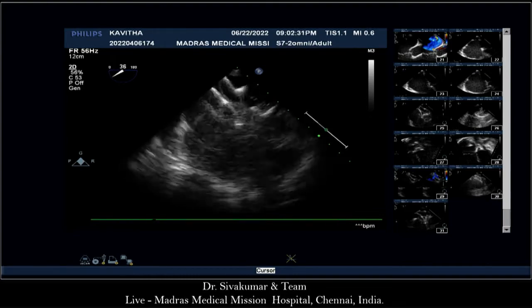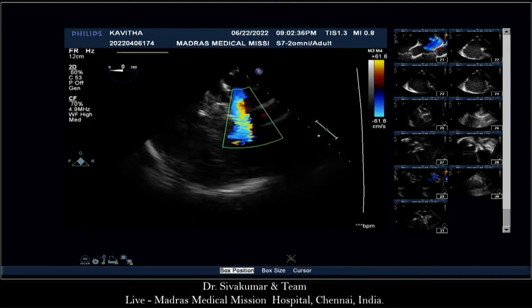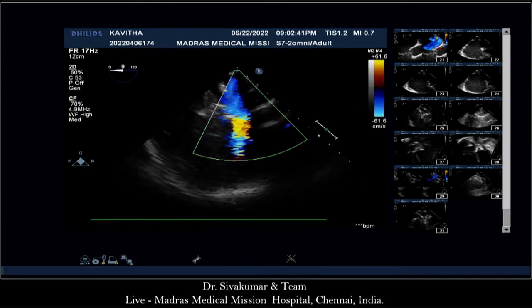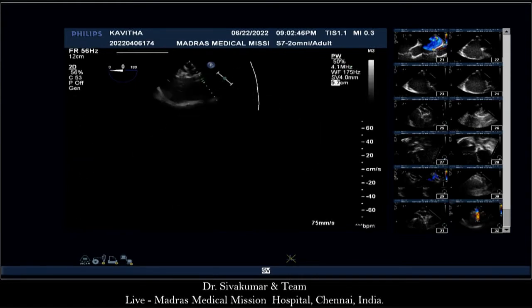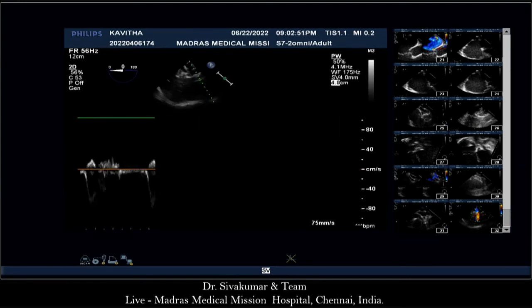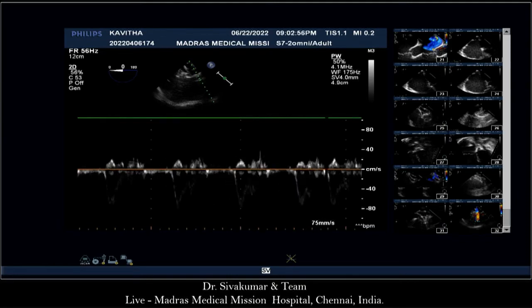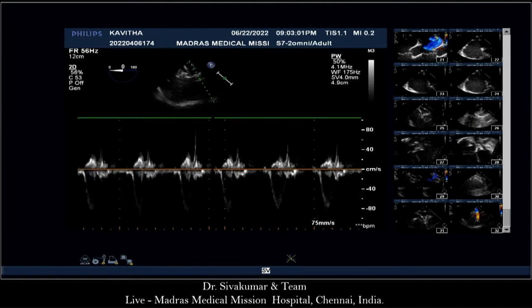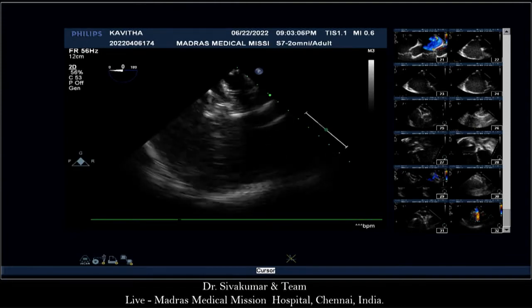And color. It'll be good, don't worry. It'll be okay. I'm trying to be like Dietmar now. The color machine is rubbish. Yeah, correct. Actually, there is some electrical artifact. Doppler, Srija, pulse wave Doppler. Make it brighter. Last transthoracic, and then we'll jump. You've done very well. Brighter, so that they see the E and A waves. Yeah, we see that, very nicely. Show us the transthoracic picture, and then we'll leave you alone.